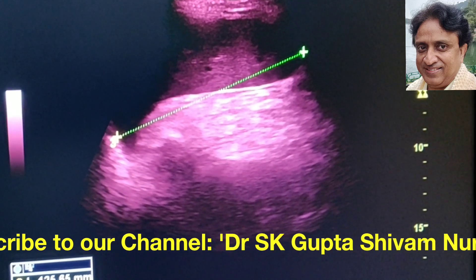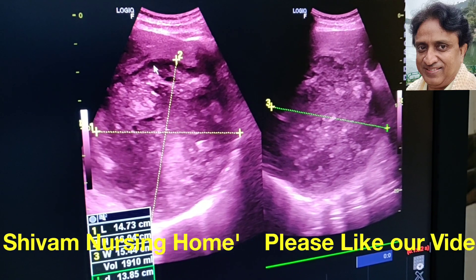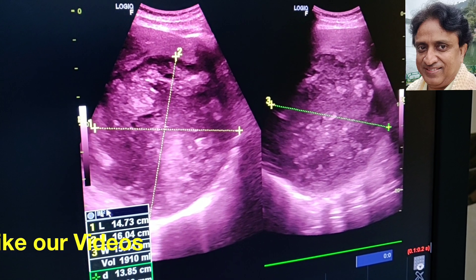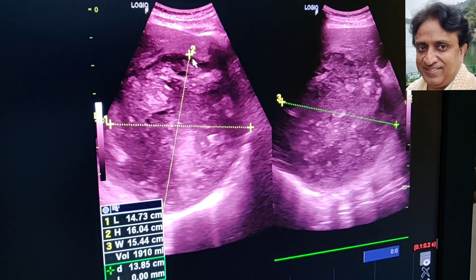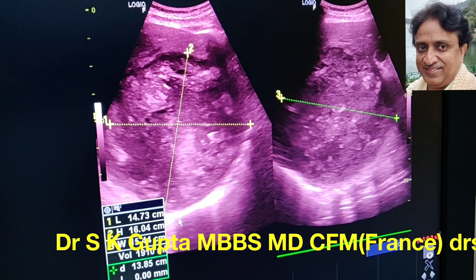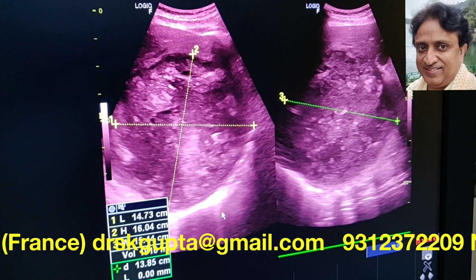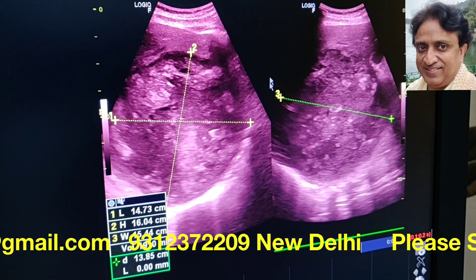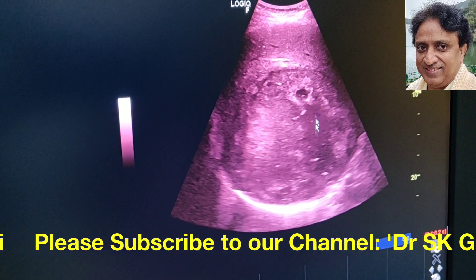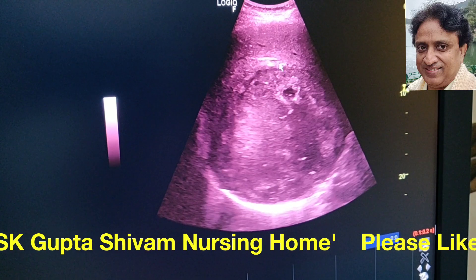Let us see what happened after the intercostal tube drainage. This is the scan of the same patient who was put on liver aspiration tube for about one and a half months. Despite the fluid being drained, the necrotic material in the liver persisted, and you can see that the size of the liver abscess has increased to nearly 1,910 ml, now occupying almost the whole liver.